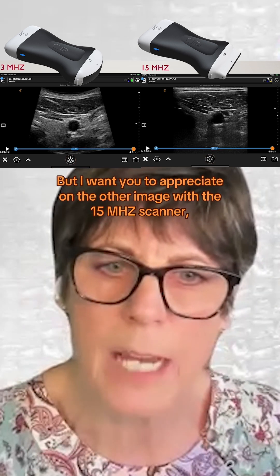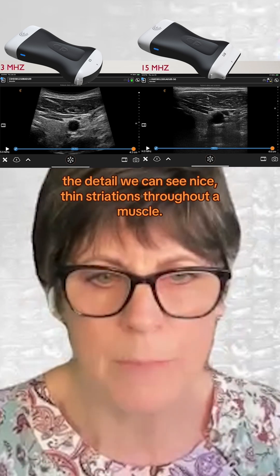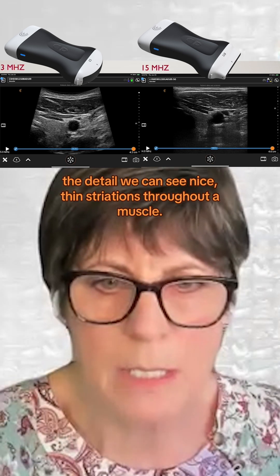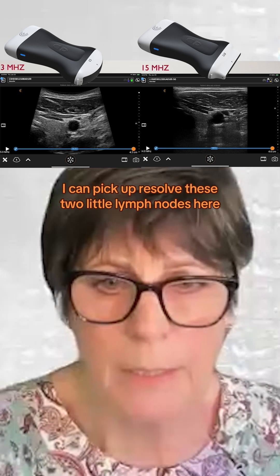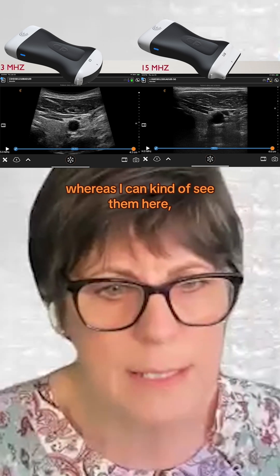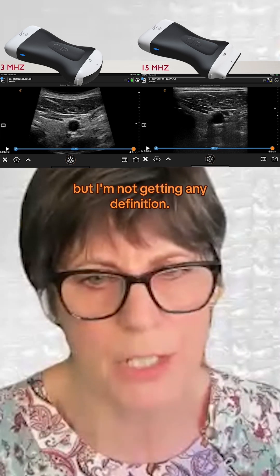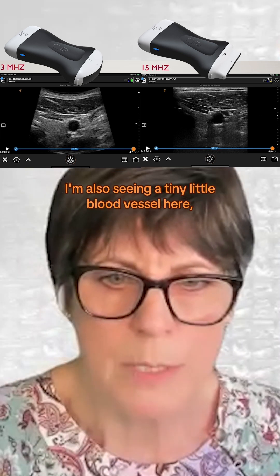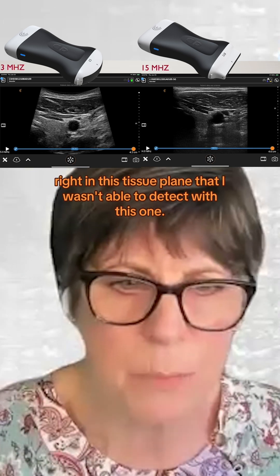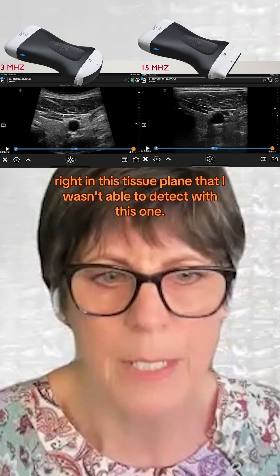I want you to appreciate the detail on the other image with the 15 megahertz scanner. We can see nice thin striations throughout the muscle. I can resolve these two little lymph nodes here, whereas on the lower-frequency image I can kind of see them but I'm not getting any definition. I'm also seeing a tiny little blood vessel right in this tissue plane that I wasn't able to detect with the other one.